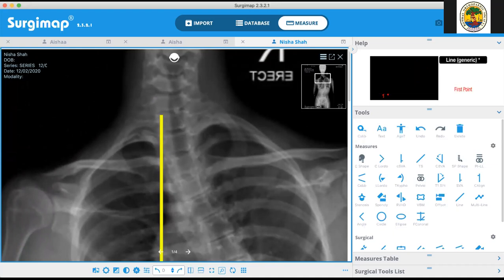Correct. But yeah, the one thing I'd say is, you are having a limb length discrepancy, or the apparent lengthening and the true lengthening, like what you measure in hip deformities. When the person actually stands and you see the actual vertical axis, this is almost like we are taking an erect film and we are measuring it parallel to the lateral border of the X-ray. That's 90 degrees. So that's fine, acceptable.